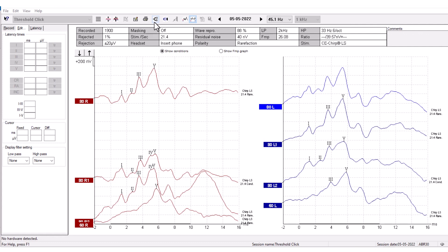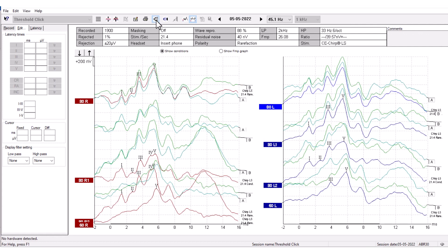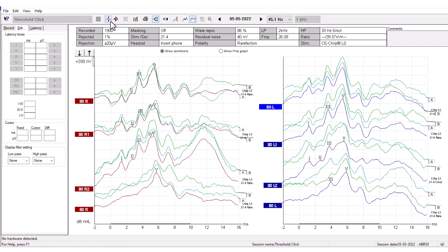When pressing this button, two more curves are presented. These are called A and B curves. The first time you press the button, all the A and B curves are stacked. By pressing Rearrange curves during the test, the A and B curves will be placed on top of their corresponding waveform.